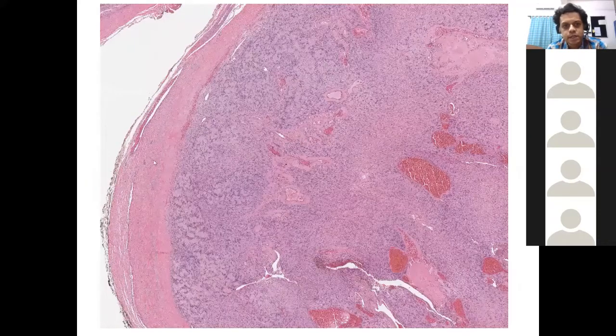So this is the outside capsule, and then going inside, can you see the palisading at this power itself? I've actually focused such an area where you can appreciate this. I'm asking the senior. Yes. So yes, sir. So the palisading is very obvious over here.